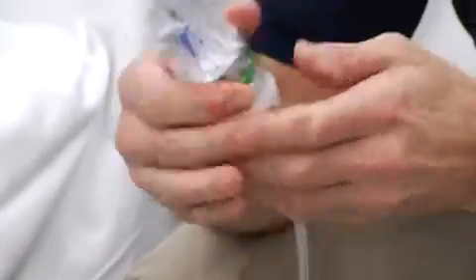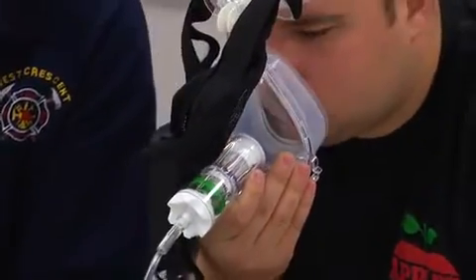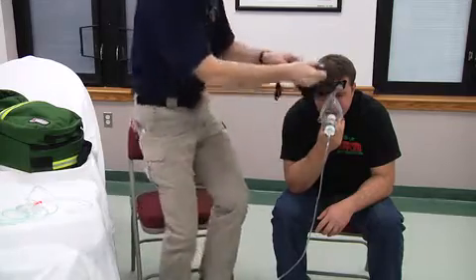I'll plug the oxygen tubing into the CPAP device, turn it on to 10 liters a minute, and attach it to the mask. Selling CPAP to the patient is best done by handing it to the patient and asking them to put the mask on their face initially. You talk to the patient, coach them, and help them relax with the CPAP in place. Once they feel somewhat comfortable holding it themselves, you can attach the helmet or accessory straps to hold the mask on the patient.